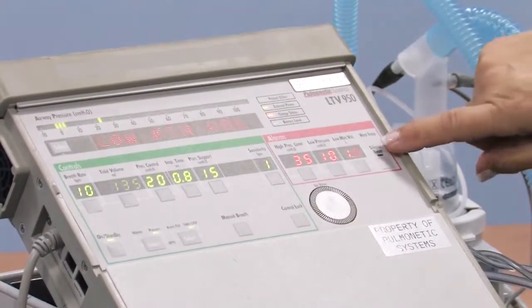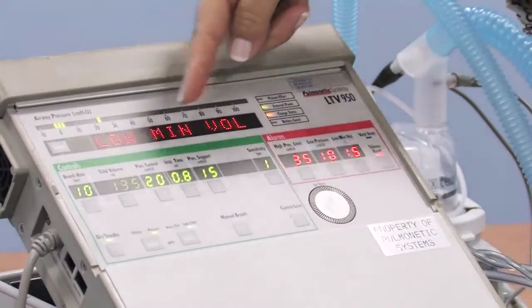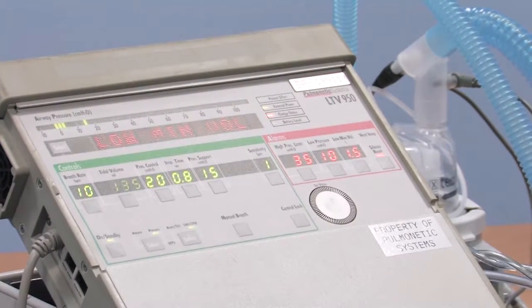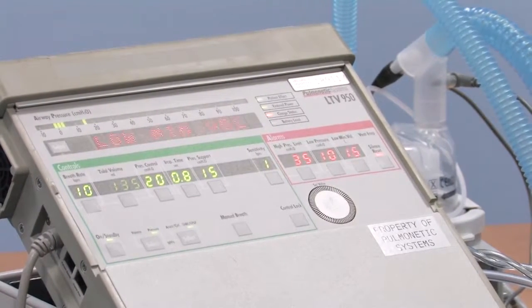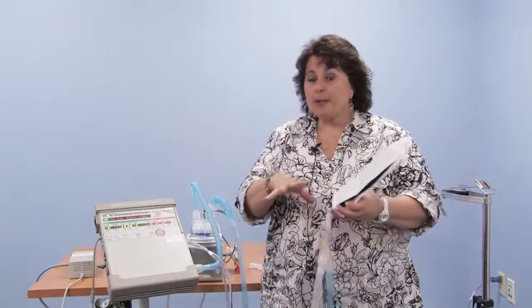So the alarm is flashing, it's audible, and it's saying low min volume because your child's not receiving the amount of air that the machine has seen them receiving recently. This is most useful during times of the child being unattended and perhaps asleep overnight.